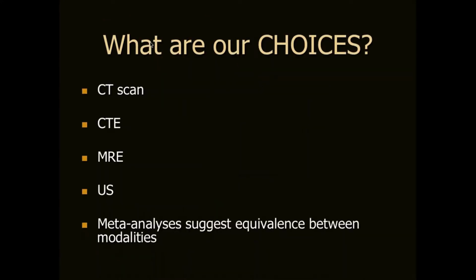So what are our choices for modalities when we're doing these scans? Well, CT scan, of course, has been a very popular technique historically, and it remains the workhorse for looking at patients in the acute situation, particularly the patient that presents to the emergency department. Now, CT enterography and MR enterography are both very widely used, and of course, there's some greater accessibility for CT, but with the recognized risk of radiation exposure in this population who has a frequent demand for diagnostic imaging.